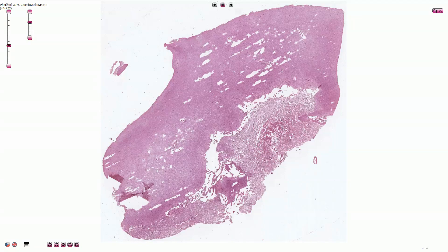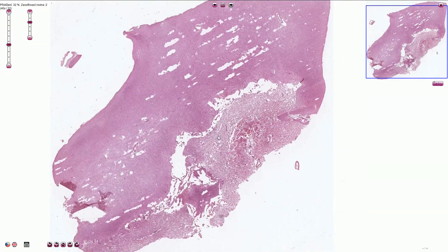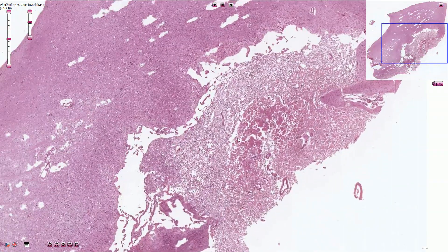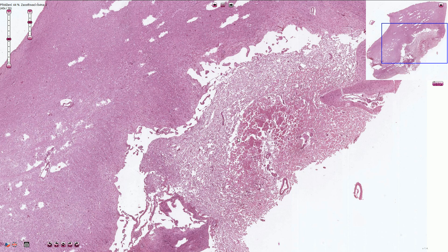Ischemic necrosis of the brain tissue has a tendency to liquefaction, which is also called encephalomalacia. While ischemic necrosis in most organs is associated with coagulative necrosis, in the brain it is associated with liquefactive necrosis. This can be explained by the aggressive enzymes from activated microglial cells, which liquefy and destroy the brain tissue.